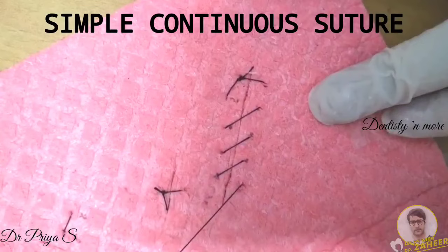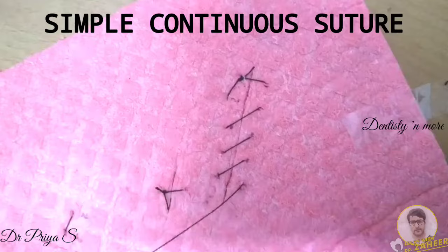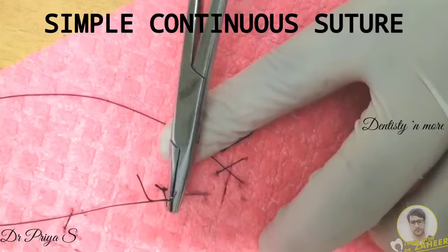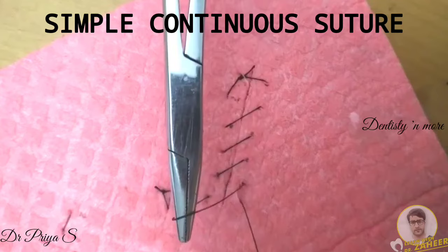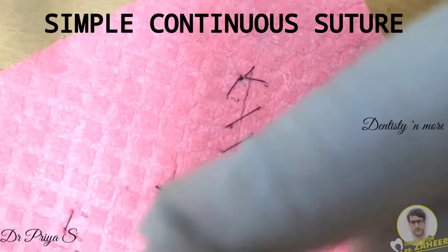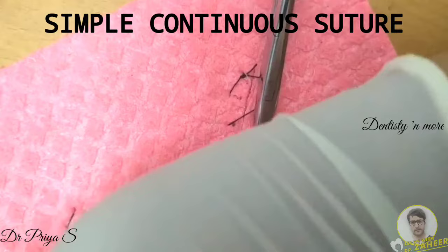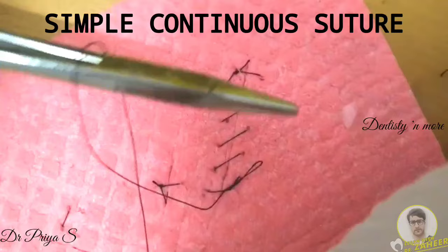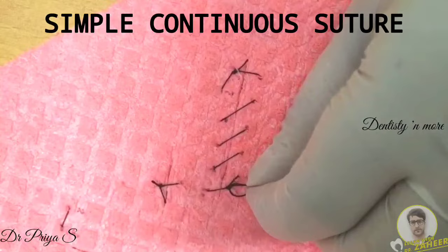Finally, you will end up with diagonal lines across the incision wound length. When you reach the final suture, do not pass the material completely through the skin — leave this loop loose for you to tie the knot. Here you are tying a knot. Once you have tied the knot, you cut the end of the suture.